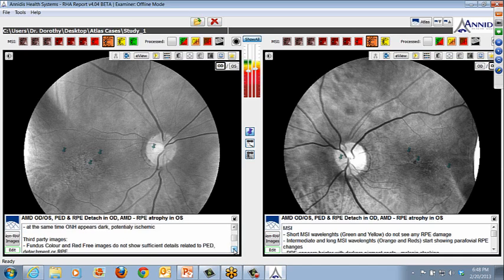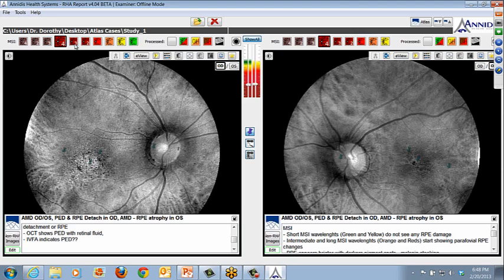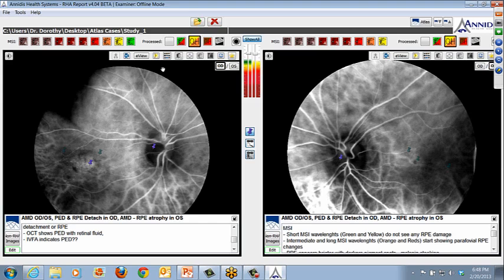It's a long description of exactly what you're seeing through each one of the spectral slices. Okay, so you can read that, you can click through the spectral slices, and you'll get some information about what you're looking at in each one. So in this case, for example, the optic nerve head is noticeably dark, a potential for ischemic or hypoperfusion when there's hyporeflectivity on the oxy-deoxy map, for example.